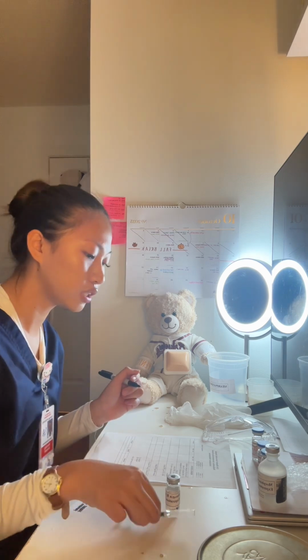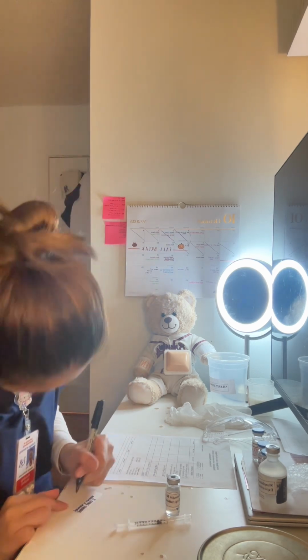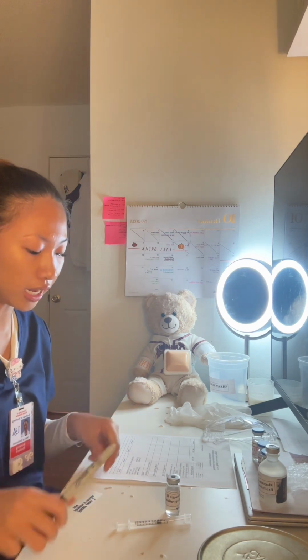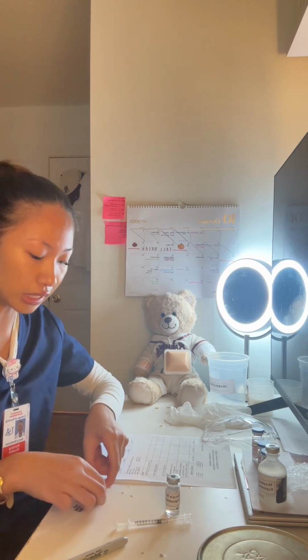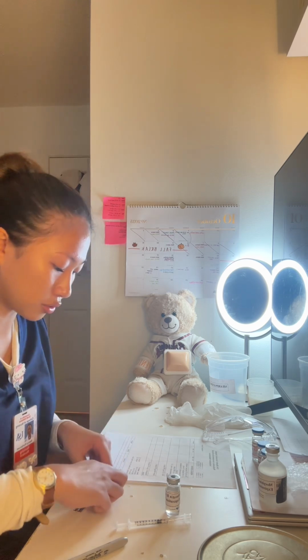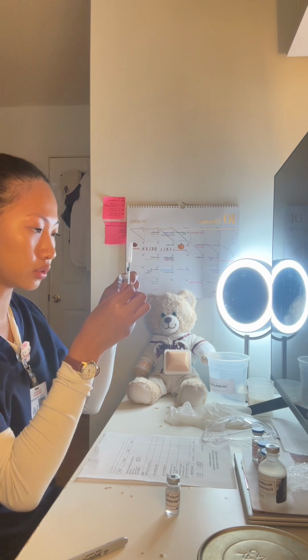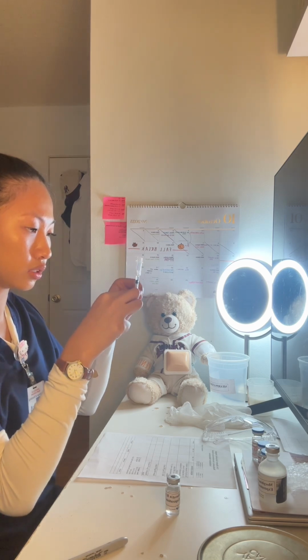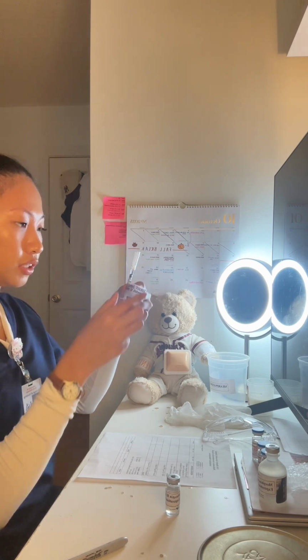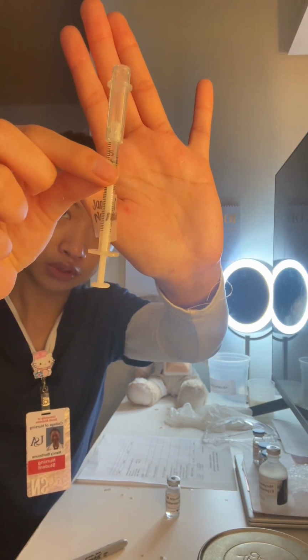And it should be 10 units, and I do have 10 units in this syringe. If I also had to do any calculations, I would get another nurse to verify my calculations as well before administering this medication. So I'm going to take this label and stick it onto the syringe here. So this is how it should look, the label on the syringe.